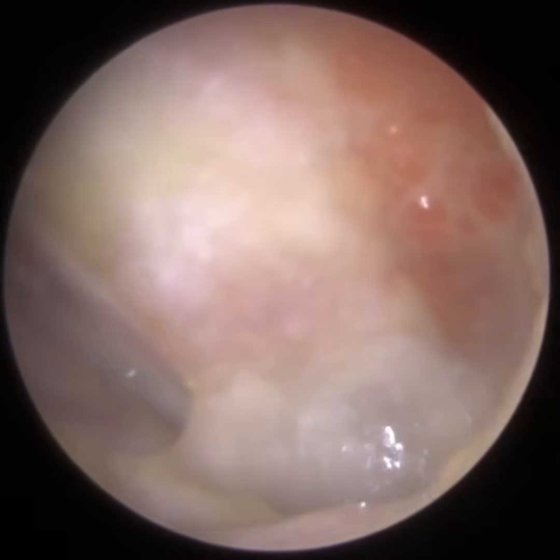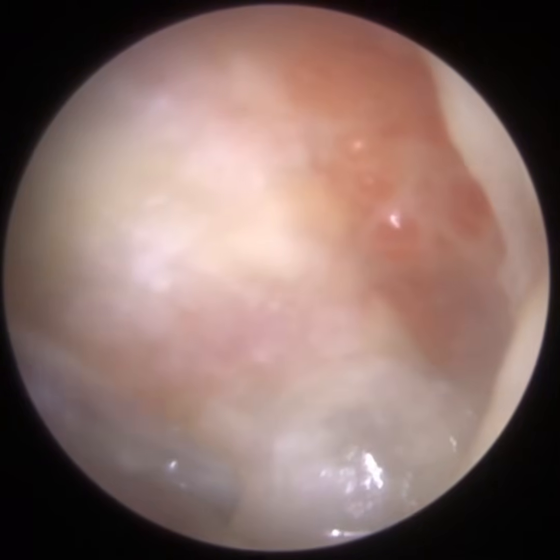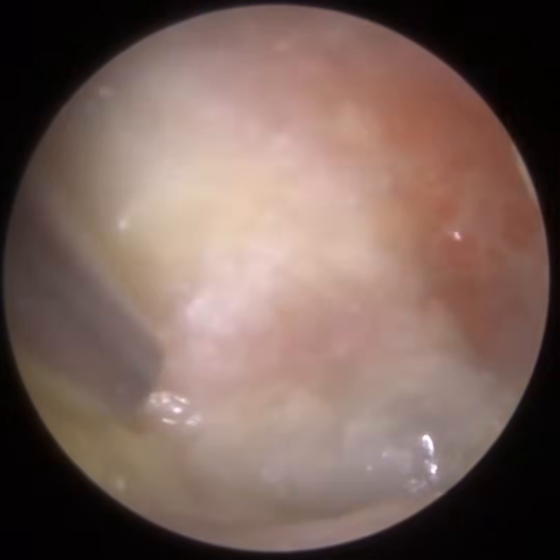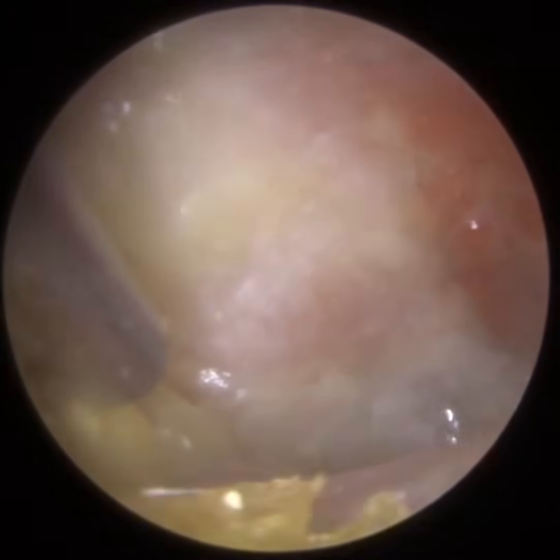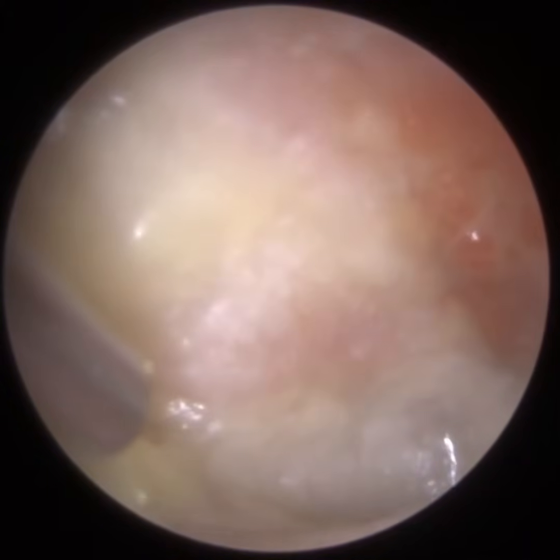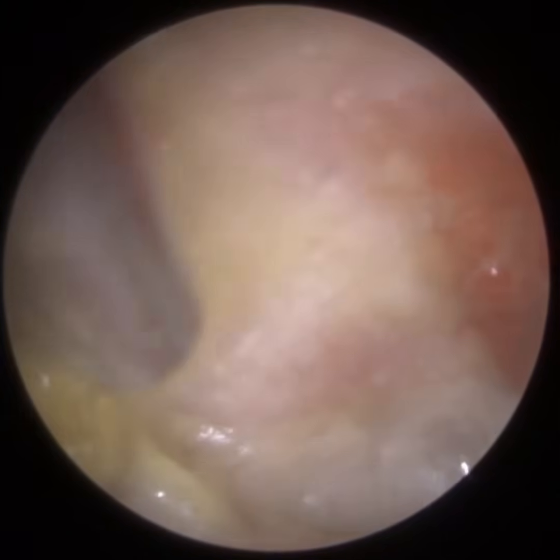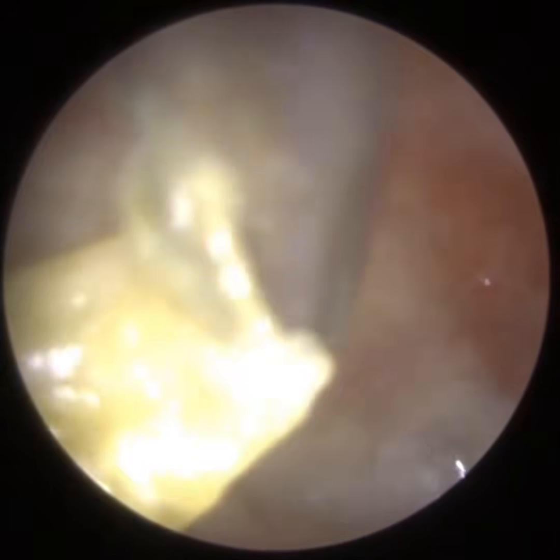And when we work this close, invariably, the patient does move. The patient's not a scarecrow. They're not a robot. So there are little head movements, even when you rest their head against the back of the couch or chair. So we have to be really, really gentle. And whenever I'm working this close to the eardrum, I'm always prepared to remove the instruments in the blink of an eye, just in case the patient makes a significant head movement, just to avoid causing trauma.